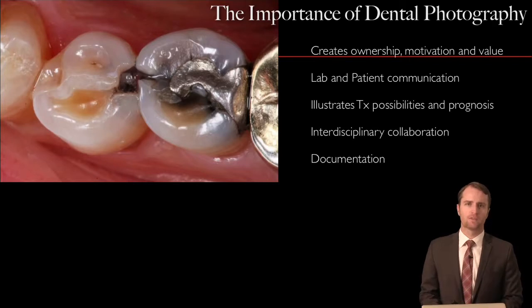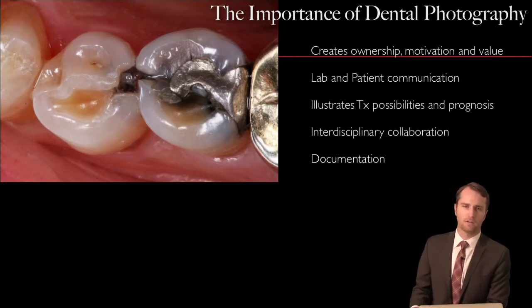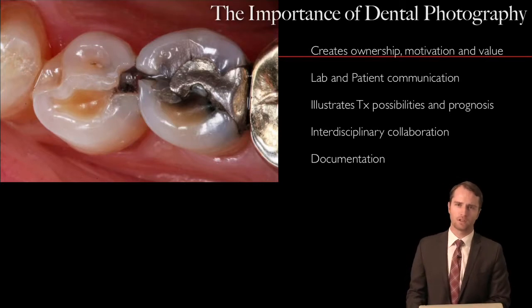The greatest advantage that I've found with dental photography is in communicating with my patients. So often patients maybe aren't motivated towards treatment unless it hurts. And with dental photography, we're very able to quickly and with a high degree of accuracy communicate to our patients their own particular pathology. So for example, if the patient's tooth is cracked but it does not hurt, they oftentimes don't want to seek treatment. What I've found through my own personal experience is that through the use of a few simple images, they become highly motivated to resolve their issues.